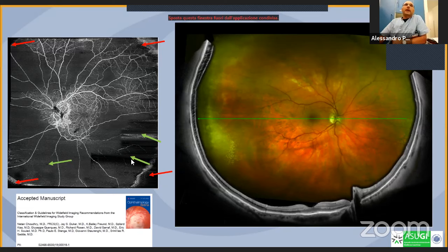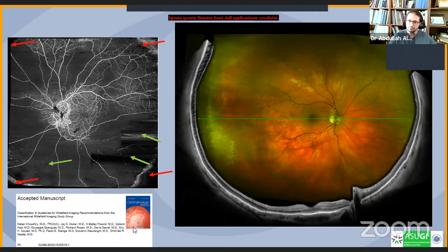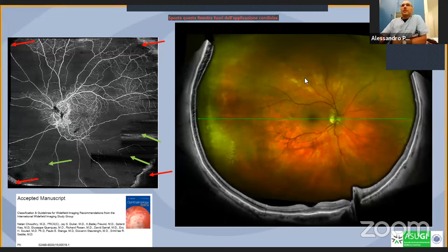So we have some artifacts due to the segmentation of the retina that is really thin. We can do imaging of the periphery of the retina in some diseases, such as diabetic retinopathy, with different modalities. We can create a mosaic, as we can see in this reconstruction that we presented at the ARVO annual meeting in September 2016. But we can do not only a mosaic and a full reconstruction of the retina, but we can also do a scan with angio-OCT only of an area of interest.